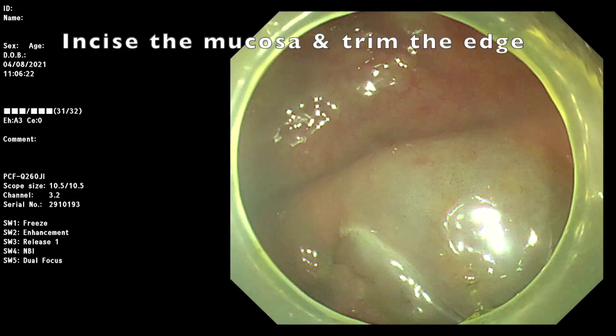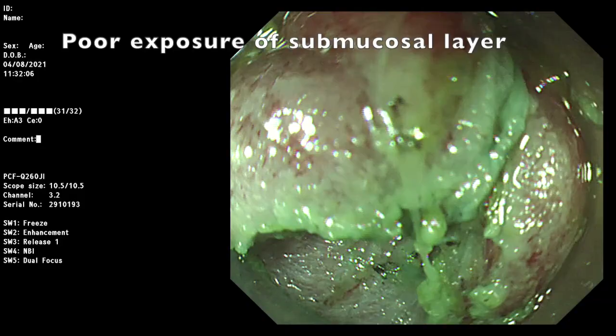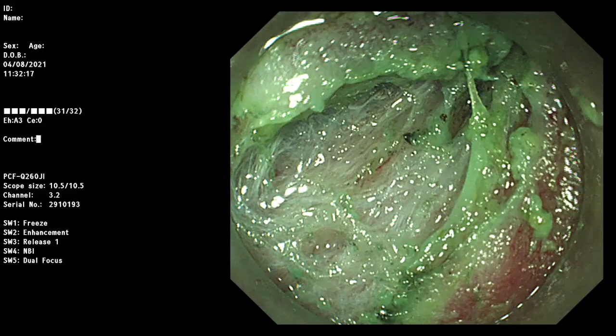However, it is very difficult to expose the submucosa layer, and also very difficult in maintaining tangential position to the muscle layer. Therefore, we adopted rubber band clip traction to facilitate the procedure.